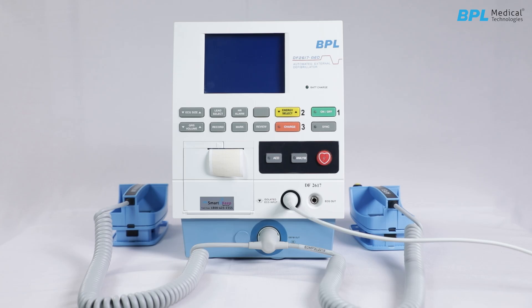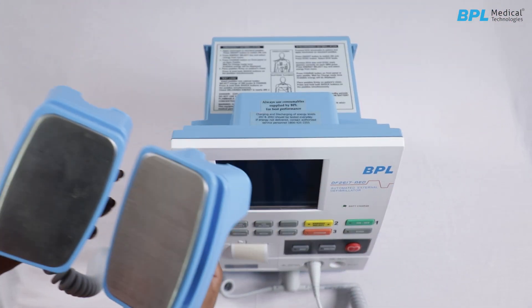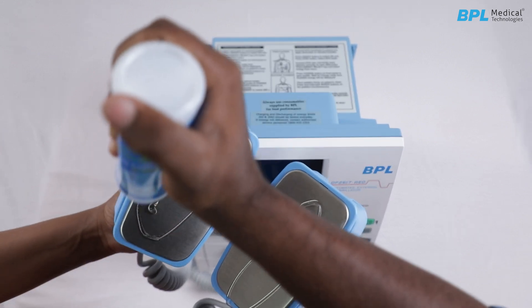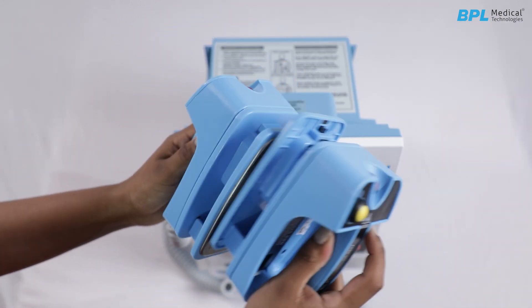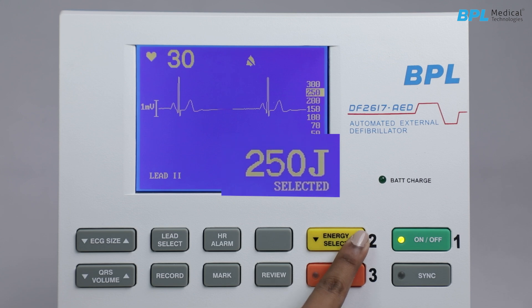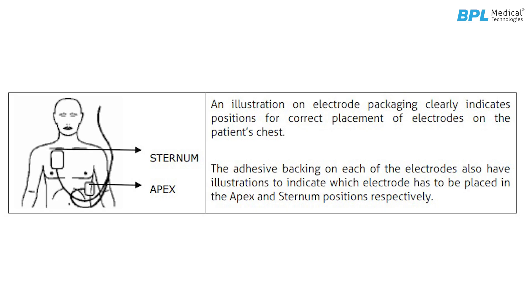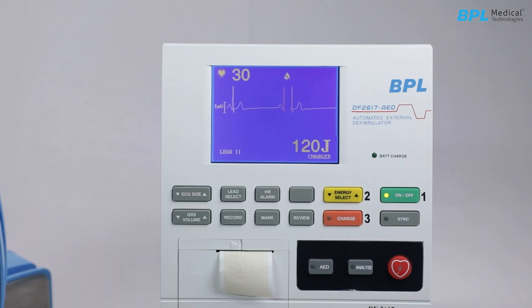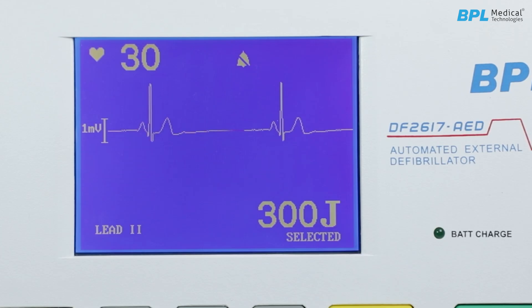To operate the defibrillator with external paddles — prepare paddles and turn on: Remove the paddles from the holder by sliding backwards and up. Apply electrolyte paste to both paddle surfaces. Press the ON/OFF key to switch on the unit. For energy selection, press the energy select key to choose the desired energy level. Place the sternum paddle near the upper sternum and the apex paddle on the chest just below and to the left of the patient's left nipple. Press the charge key on the front panel keypad or on the apex paddle. The device begins charging and the increasing energy available is displayed on the screen. The device can charge to 300 joules in less than 10 seconds when used with a fully charged new battery.